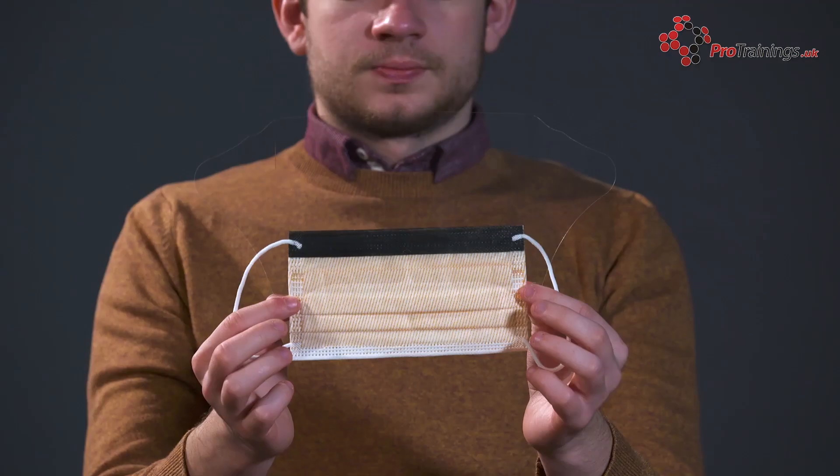To remove the mask, first wash your hands correctly and use alcohol gel to avoid transferring infections to your face. Remove the mask by only touching the edges, straps, loops, ties, or bands. Do not touch the front portion of the mask, which may be contaminated.